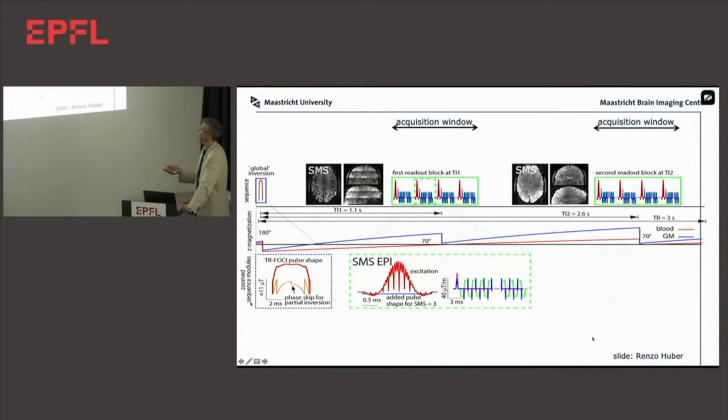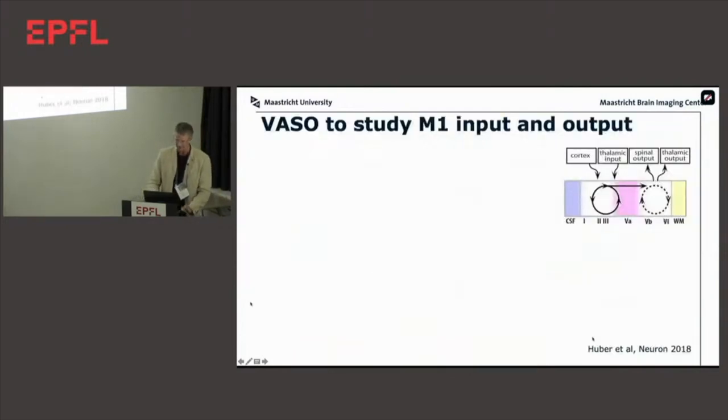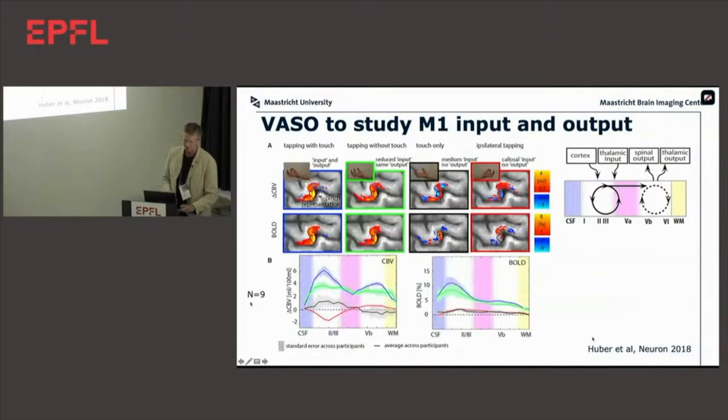And the signal continues sort of recovering, and they have another readout which is BOLD weighted, and then you can actually use that for simultaneous BOLD acquisition, but also do a BOLD correction on that other more interesting signal that you really care about. Anyway, so this is how it works. You can actually do that with a multiband, as I just showed here, but you can also have a 3D EPI readout with CAIPI or not, as you wish. And that allows you to actually get to effectively somewhat higher spatial specificity than you can easily do with BOLD, at least.